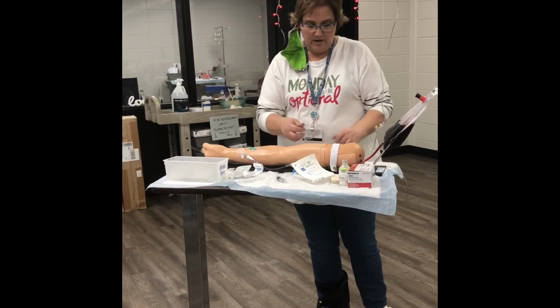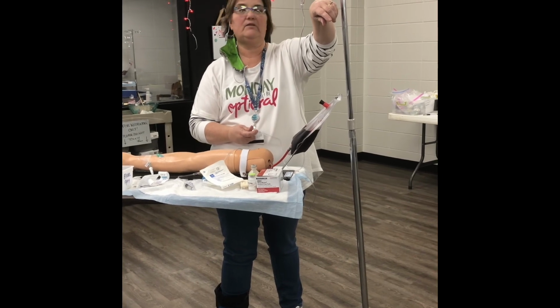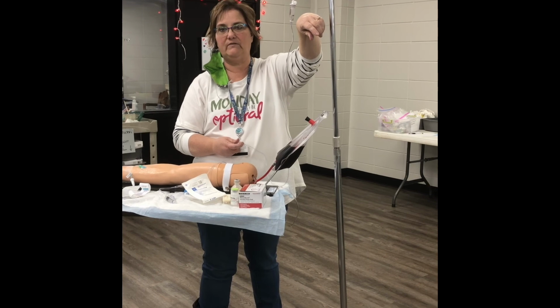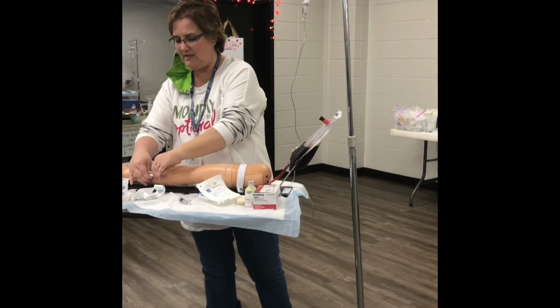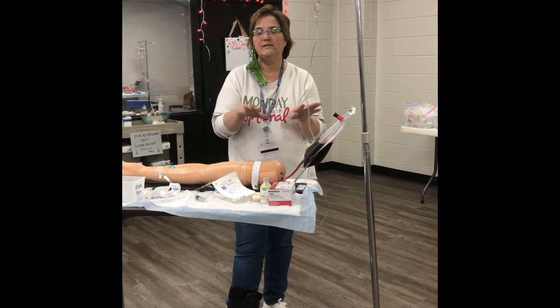All right, so we would start this up. However you think 32 drops per minute, or 8 drops in 15 seconds, looks, you would count them for 15 seconds and then speed it up or back, whatever you have to do. We get 8 drops in 15 seconds. We count for a full minute to make sure we have 32. And once that's done, you're finished.